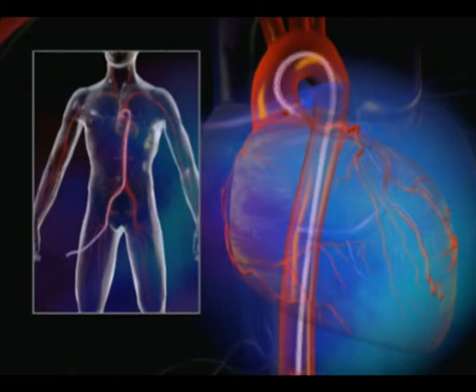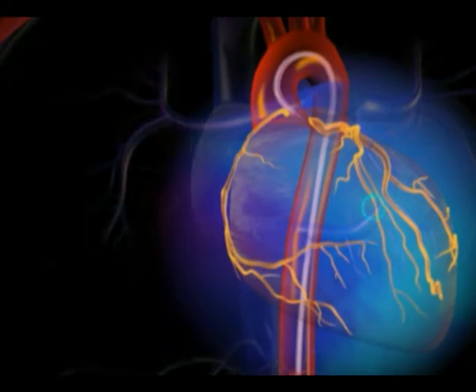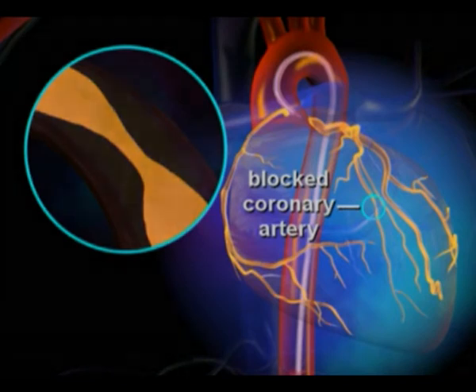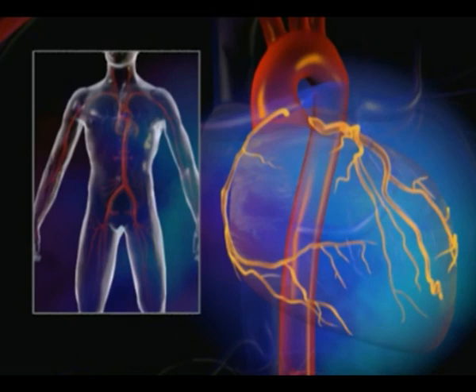Once the catheter reaches the aorta, a contrast dye is injected. When the dye flows from the aorta to the coronary arteries, an X-ray or angiogram is obtained. The image taken during angiography will show if there is any blockage, aneurysms, narrowing, or other abnormalities in the arteries. Following the angiography, the catheter and guide wire are removed. If treatment is necessary, the physician can recommend appropriate therapy.